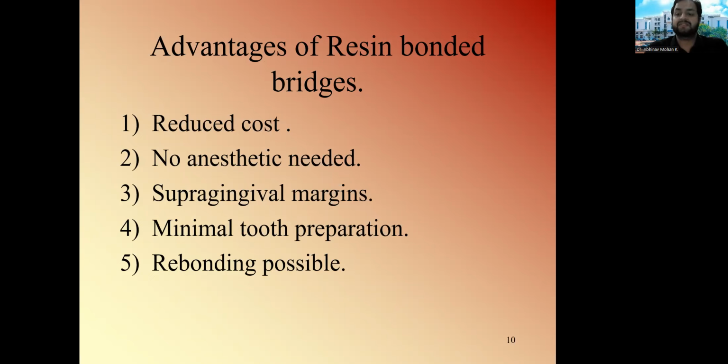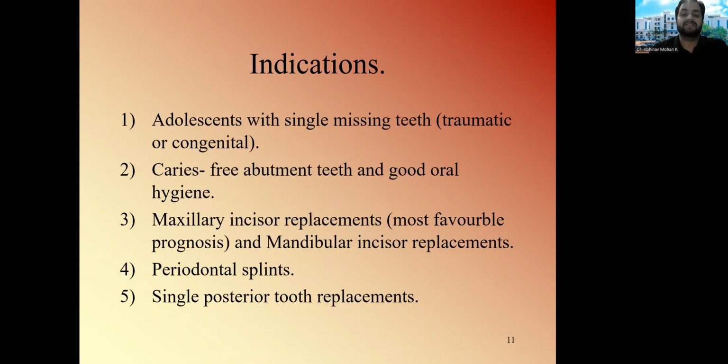And even if the prosthesis is lost, you always have the option of rebonding the same prosthesis. You may not even need to consider refabricating the prosthesis. We can use the old prosthesis and refix it.